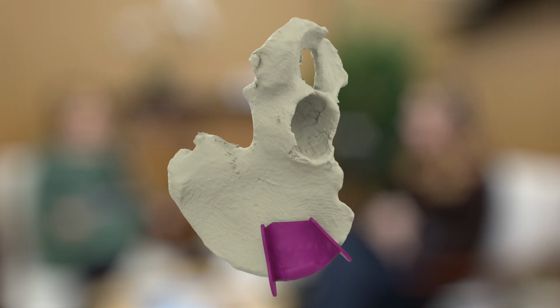In Freeform, the planes are used to cut the bone. Okay. That will then leave us with the defect. And then we can start using all the different tools where we can manipulate the pelvis into the space of the defect, generally just moving it, rotating it so that it's sitting nicely within the defect model. And obviously that's the sort of advantage of the haptic as well. It gives you that ability to move it freely within the 3D space and check all the different angles of where it's sitting against the native bone that's still there.